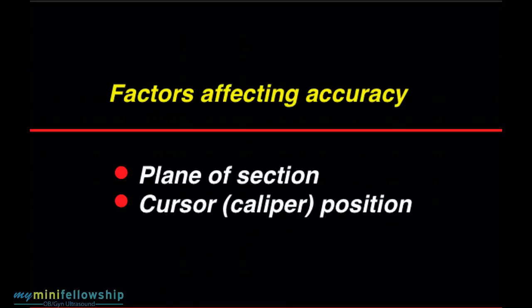So it's important to understand that there are many factors which affect the accuracy of a measurement during an obstetrical sonogram. And while the list is long, the good news is that almost everything on that list belongs to the manufacturer. So if you have your ultrasound machine serviced at regular intervals and checked by the manufacturer, almost everything is removed from the list, and you are left with the responsibility to do two things.